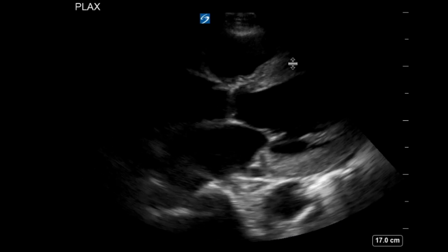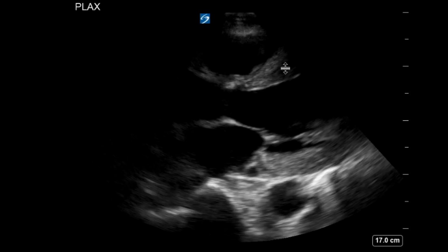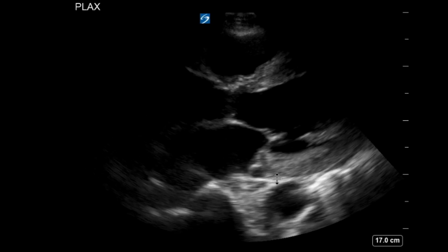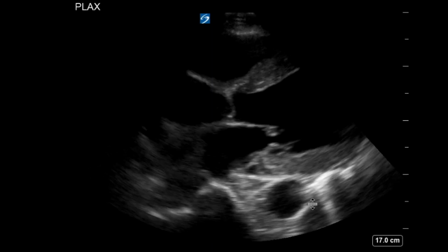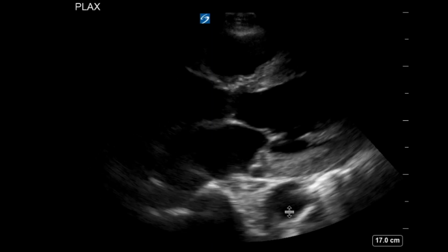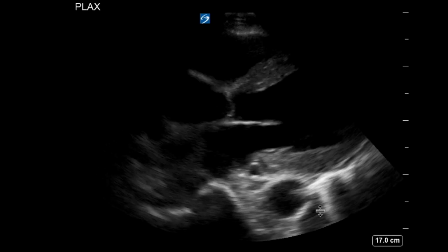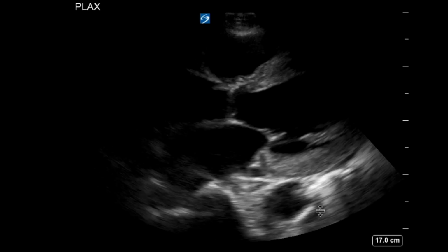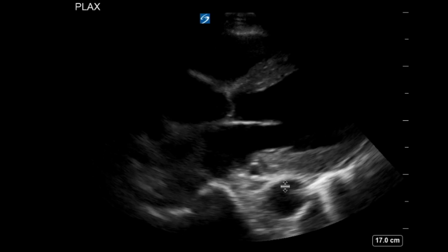What about over here, the anterior portion? Yeah, that's our right ventricle. Right ventricle, good. And then deep to the heart, we have another structure here, circular, caught in transverse view here. What is this? That is our descending aorta. Good. So this sonographer did a good job of keeping the descending thoracic aorta in view while capturing the parasternal long, but why is that important?